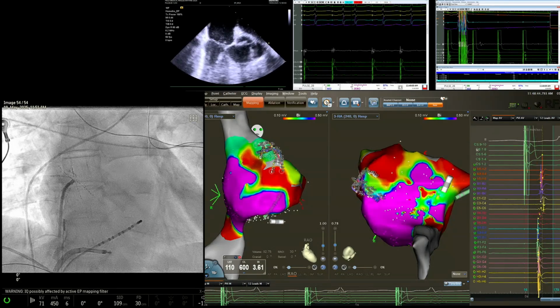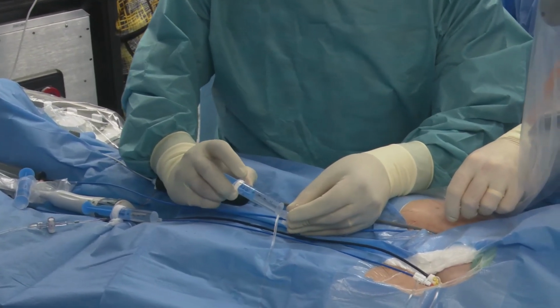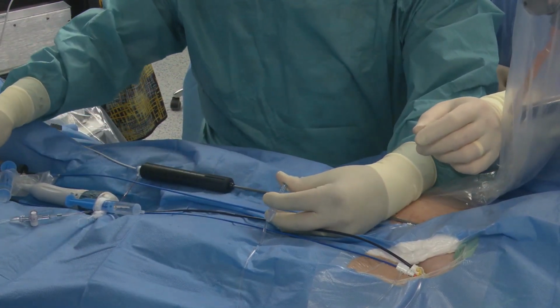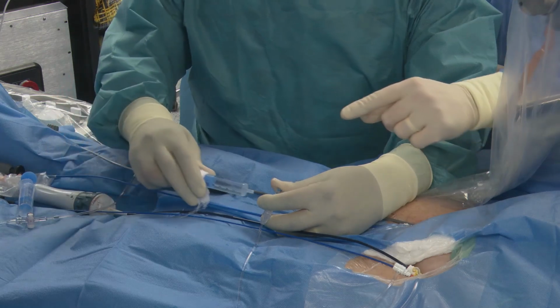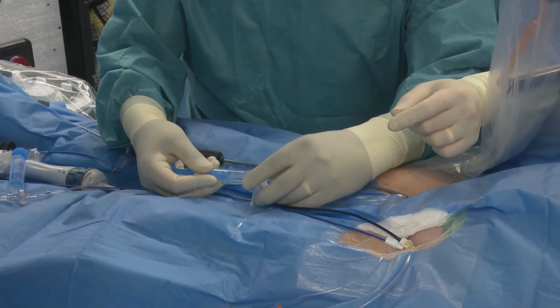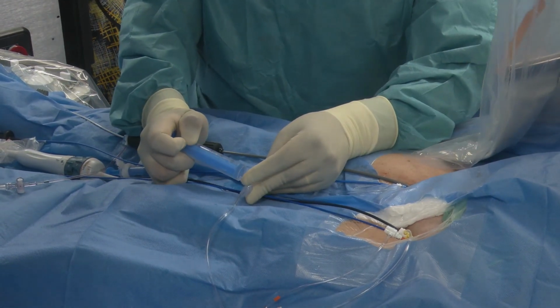We're going to do something very similar. First, I'll give 300 mics of phenyl. I don't think I want to give all of it. Then I'm going to give nitro also. Then let's flush. I need a bigger flush, Chief. Okay, let's go ahead and start the clock, please.